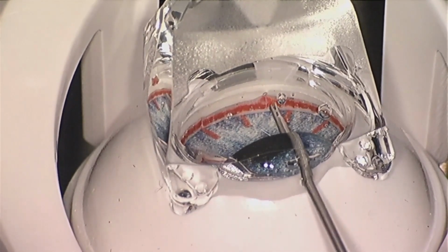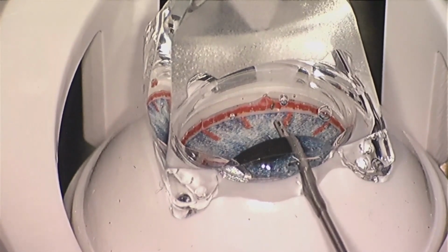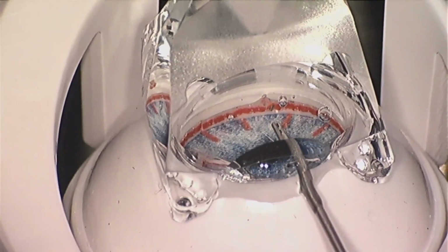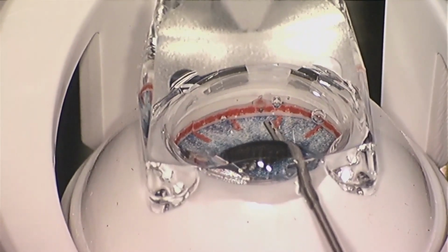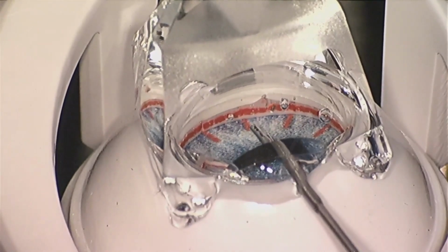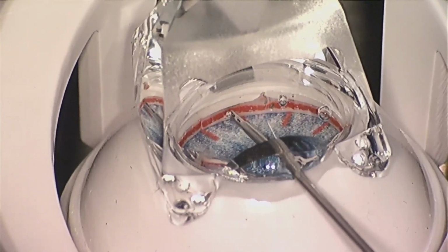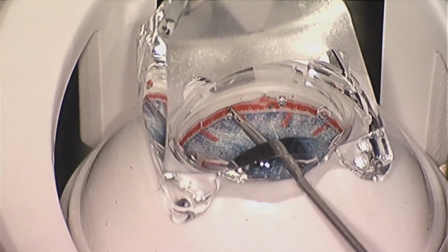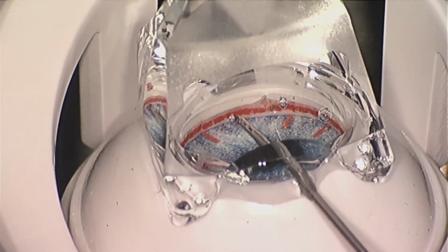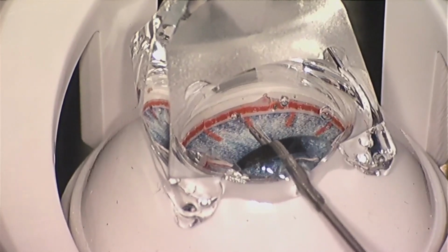I had a little bit of trocar bias there, and again, I'm getting used to the tissue in the wet lab. This is my first time placing the stent. So what I do is get it in good position and then click the button again, and the second stent launches down and hits the first stent and puts it into good position, kind of like two croquet balls hitting against each other. So now I get ready to fire the second stent. Again, I've got a good feel for it, so I go ahead and push the button, trying to avoid any trocar bias. And that one's pretty good, but it's not quite seated properly, but it's in good position.